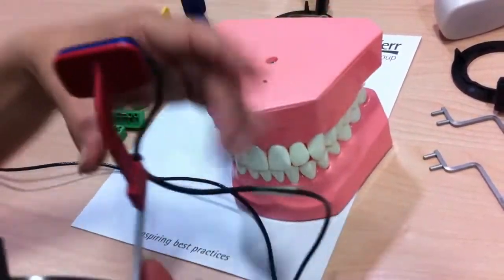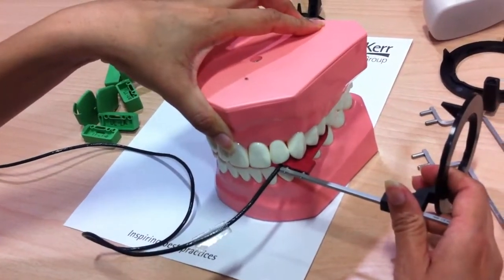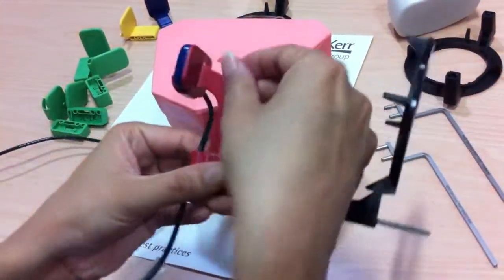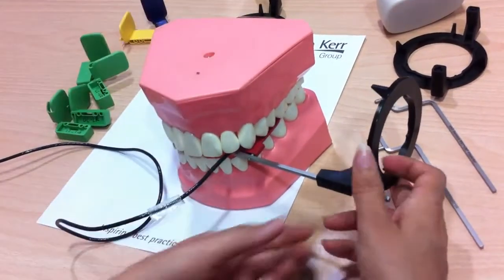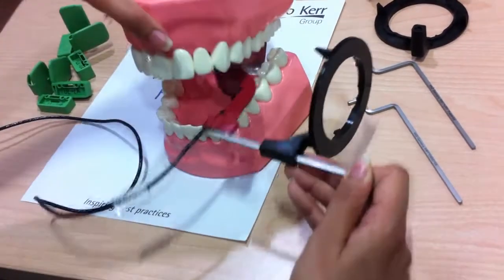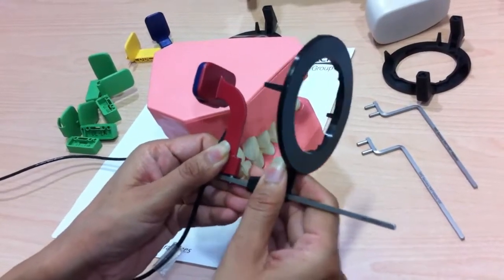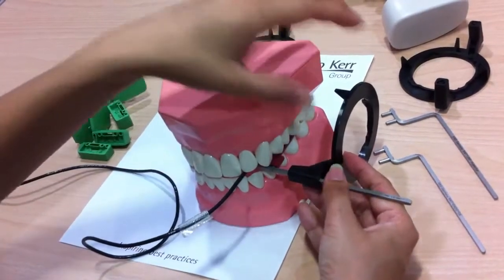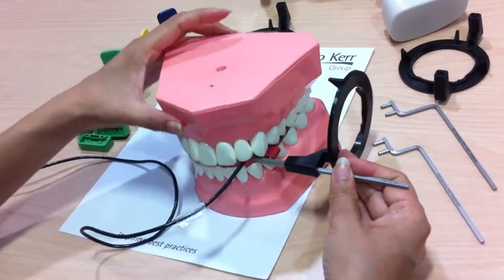This is the vertical bite-wing again, usable for both right and left sides. We need not worry about the wire because the patient is going to bite on the surface of the holder, not on the wire. We also need to make sure that the aiming ring is as close as possible to the patient to avoid any distortion, magnification, or noise in the image.